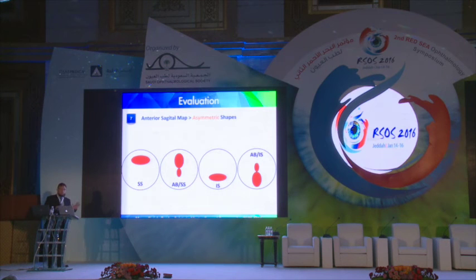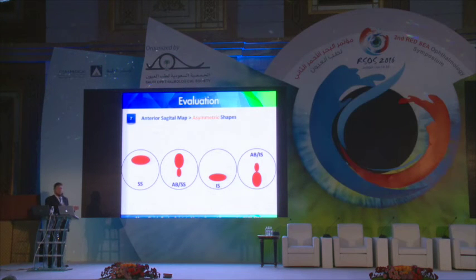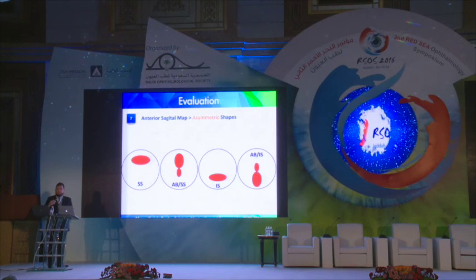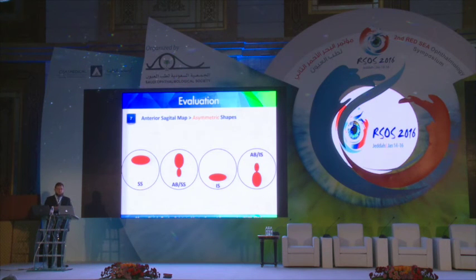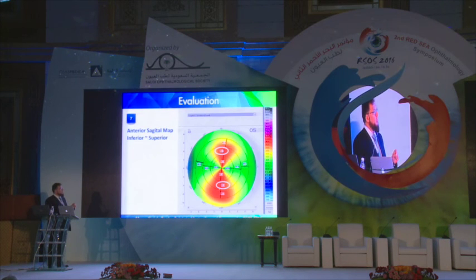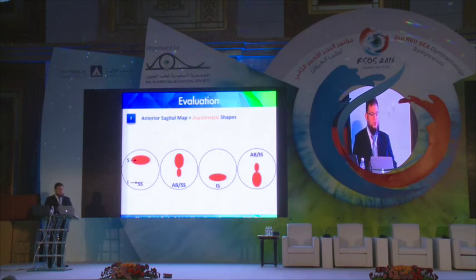We used to say that these shapes are abnormal. This is not true. They might be normal. We will see how. We have to look at the 2 opposing points on the 5 millimeter circle or 4 millimeter circle, as you see here. And then I go back to these pictures.